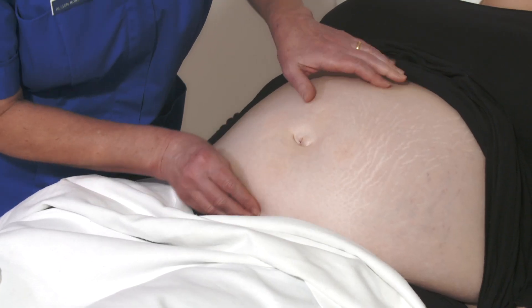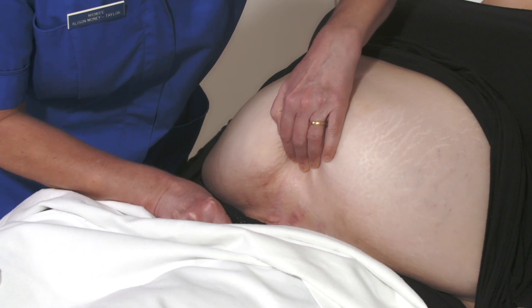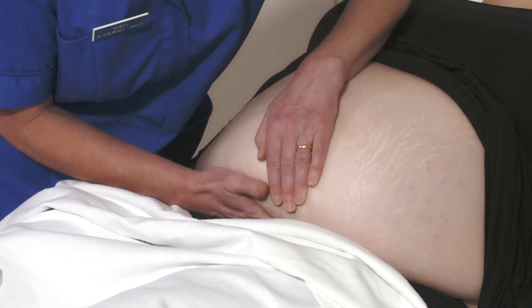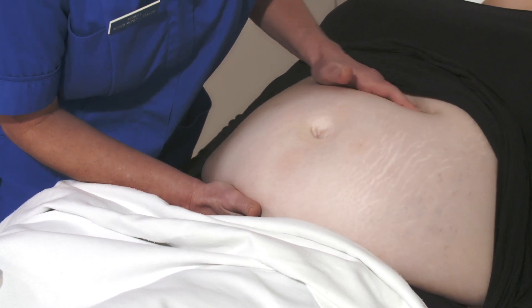If you can palpate the fundus and can estimate the location of the symphysis pubis, then you can place the patch plastic clip on the midline, midway between the fundus and symphysis pubis. In this patient, the umbilicus is not displaced.